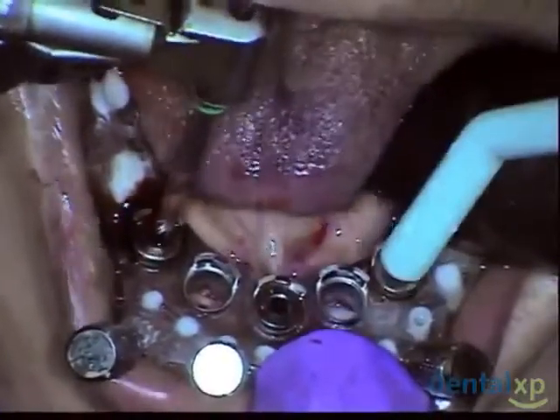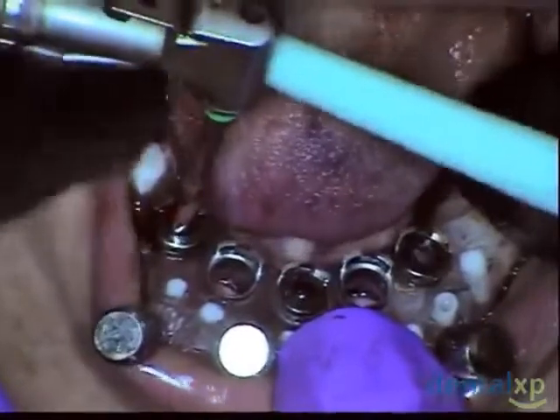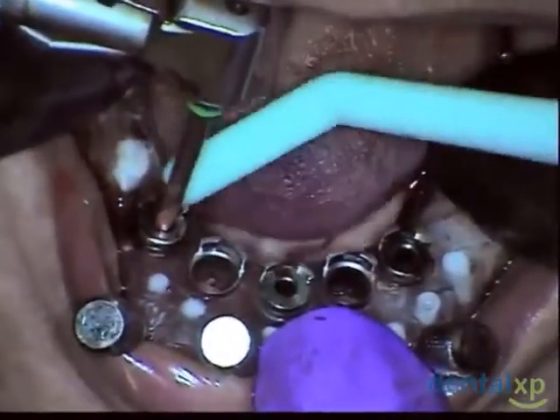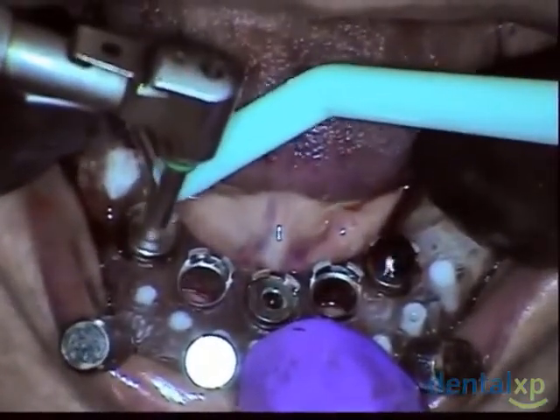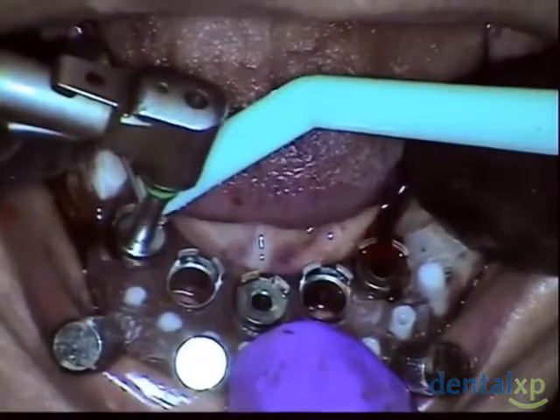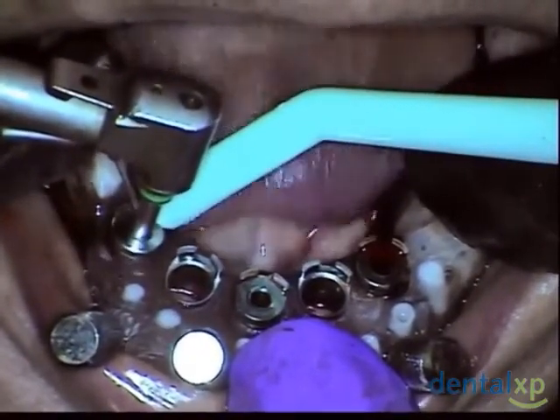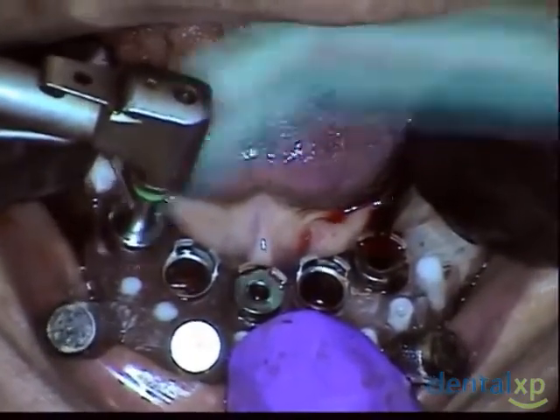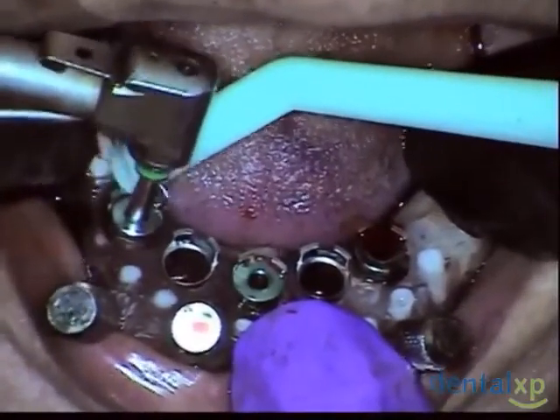And because you did the treatment plan, you know where to expect the bone to be much more dense, and therefore with this guide, I may have to go up and down just a little bit to allow my burr to be more efficient with the cutting. But I know that when I do that, I'm still going to have a stabilized osteotomy site. Now I'm going at 1800 RPM and 55 Newton centimeters of torque.